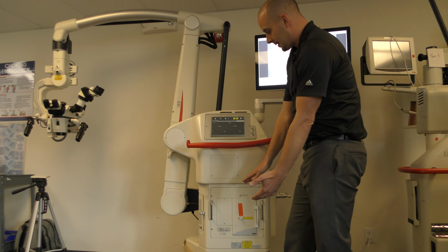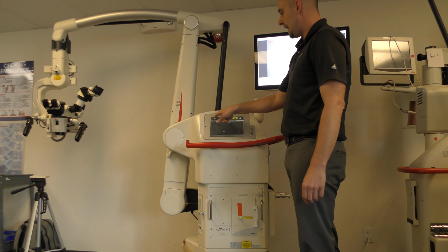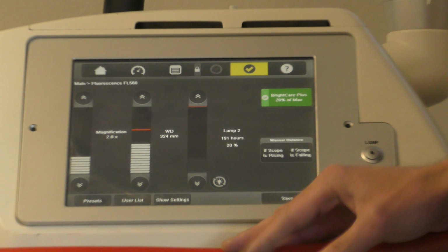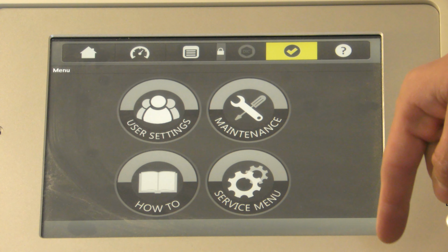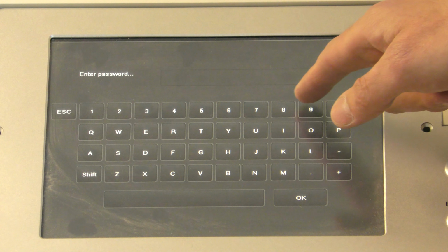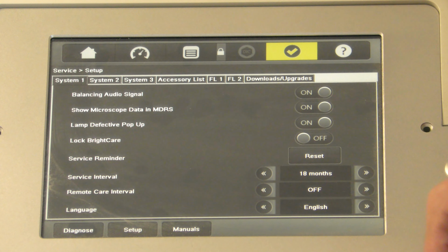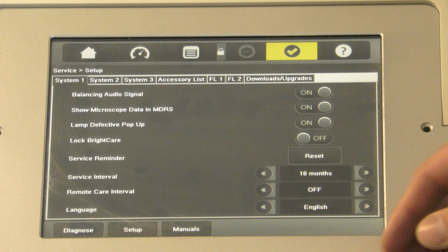So once I've addressed the light bulbs, then I'm on to the control unit. At the control unit, the first thing I would do is go into the service dialog. Plug in your passcode, whatever that is. On the OH6, you're going to be faced with this. It immediately shows you the setup screen.